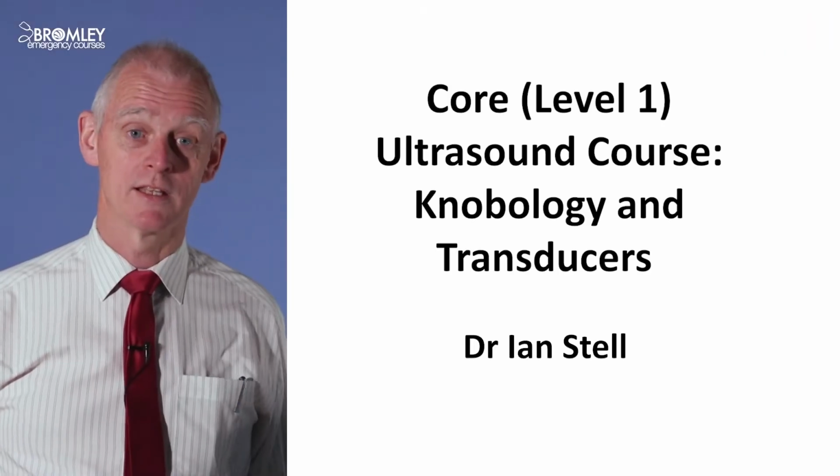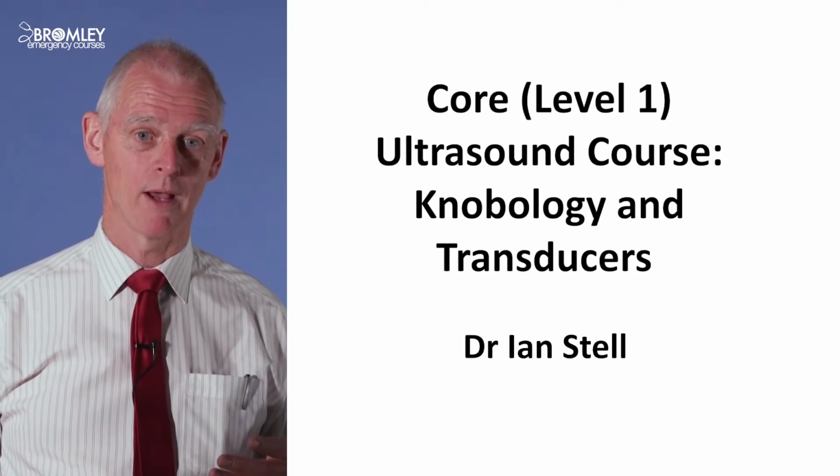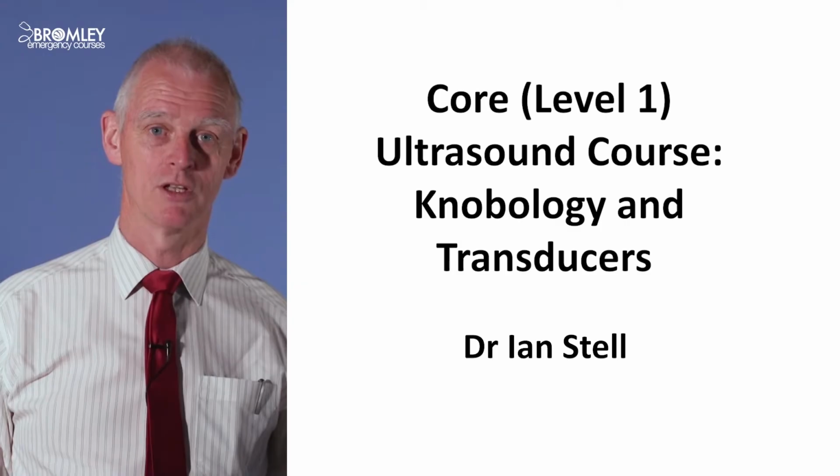Hi, my name's Ian Stell and I'm going to be doing the first of these tutorials, and I'm going to be talking about what we call knobology, what do all the buttons on an ultrasound machine do, and about transducers or probes. So starting off with knobology.